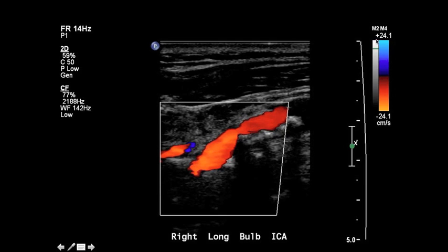Looking at the scale for this particular image, the blue colors are signifying things that are moving in the positive direction, which is defined as moving towards the transducer, whereas the red and orange colors are depicting blood flow that's moving away from the transducer in this particular image.